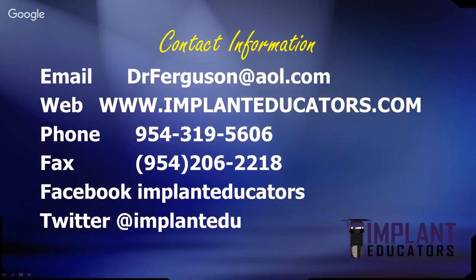Okay, so let's take a few of those questions. On that previous case that you presented earlier, how did you fixate the second guide? So there are tools available. You can use actually impression copings. With that particular system, they actually had a tool to fixate the guide to previously placed implants. So some systems have that, others don't. That particular system I was using, that tool is compatible with Zimmer compatible implants. So if you want the information on that, just email me. I'll tell you where you can get that particular tool.